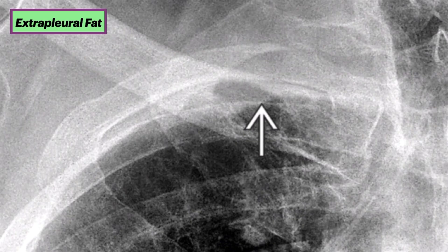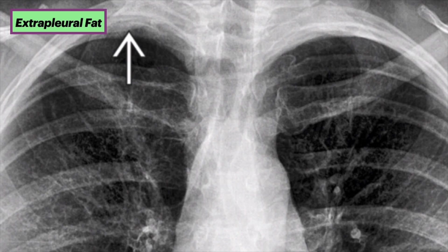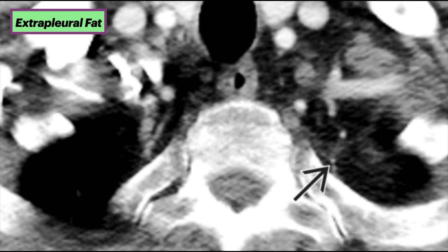The next case is simply extrapleural fat. This frontal chest x-ray, coned down to the right apex, shows a right apical cap exhibiting sharply marginated and undulating borders. Note the absence of rib destruction. Coned down to both lung apices, note the bilateral though slightly asymmetric apical caps, slightly thicker on the right. Axial CT shows that the left apical cap is composed primarily of extrapleural fat.